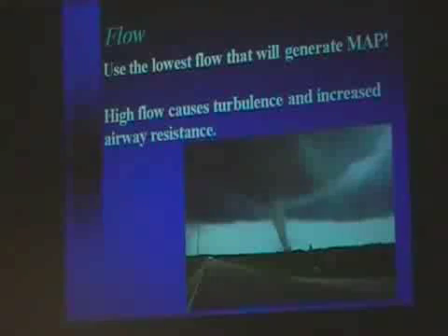One of the things you need to do when you look at the ventilator is see where the flow is, because it's usually set by the therapist, and they're getting much, much better at it now. In fact, I haven't seen 20 in a very, very long time. Little tiny babies don't need more than about 10 liters per minute. Some need less. So just check it and make sure that it's at some sort of reasonable place.